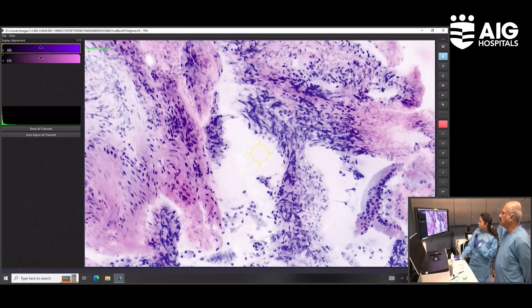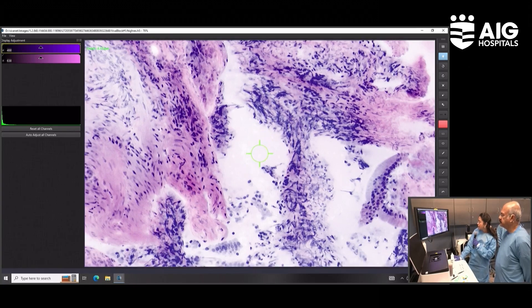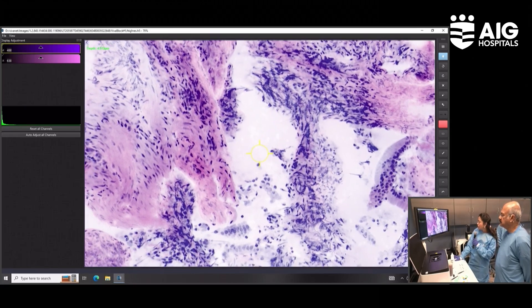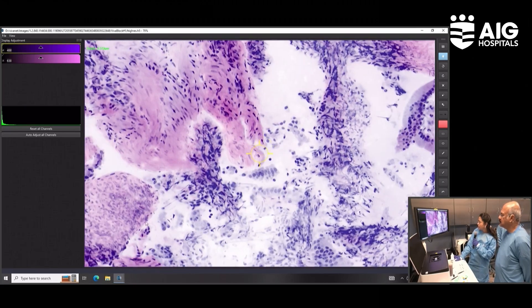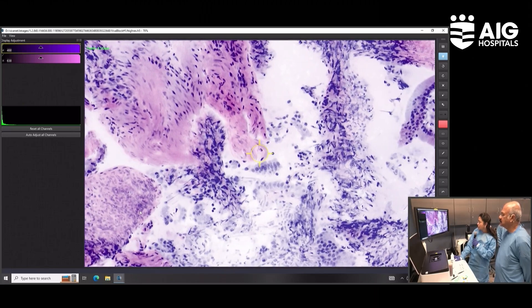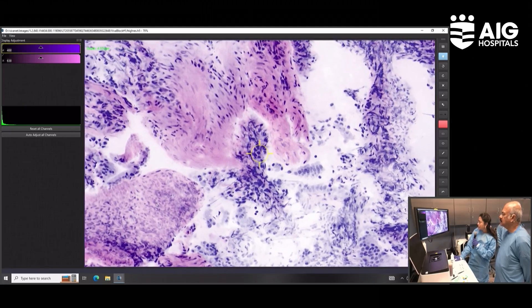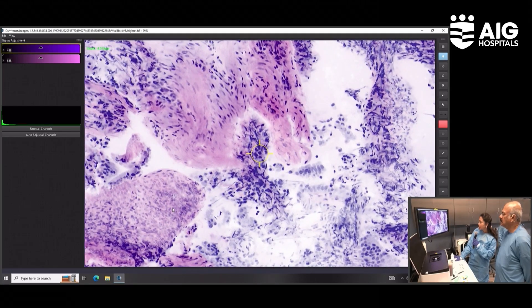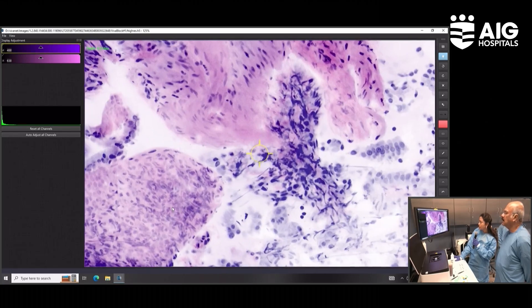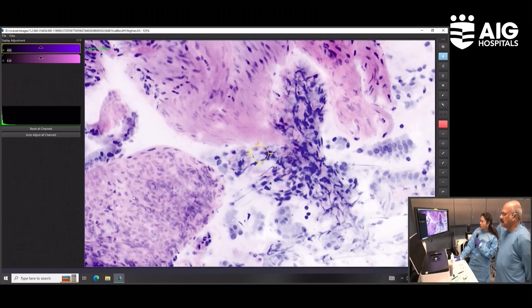That means there is no dysplasia of the lining epithelium, and you have some nests of cells. Probably we are dealing with a round cell lesion, and we might have to do IHC to further delineate what kind of lesion we are seeing here.